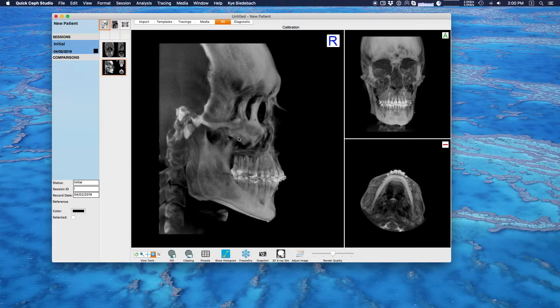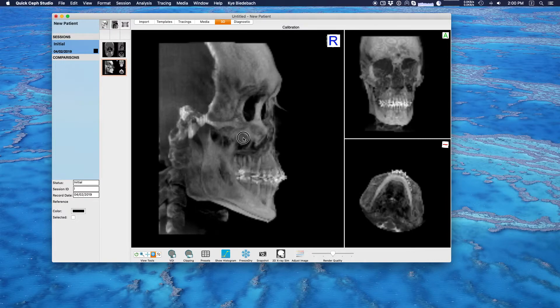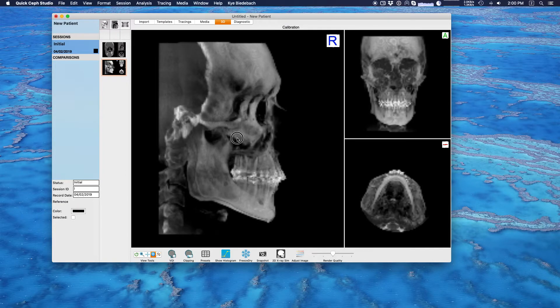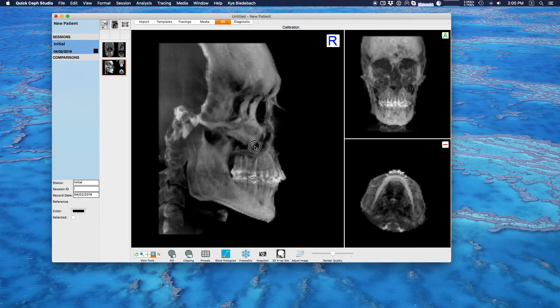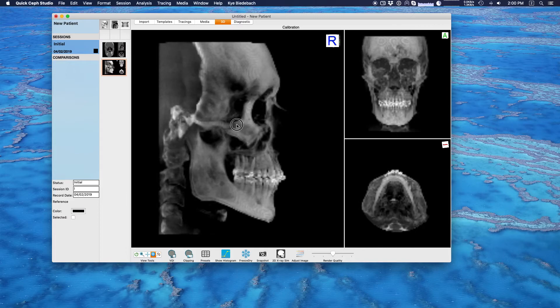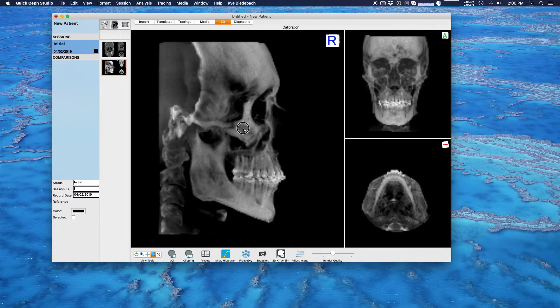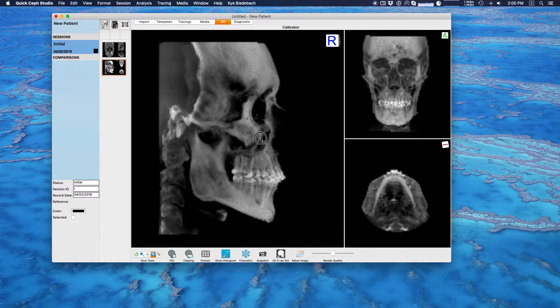There's the one I chose. You can see it's slightly askew — often the data will be a bit askew because the patient isn't maybe sitting straight in the chair. To calibrate this, all we're doing is lining up the orbitale and the hinge axis to make it look level. I can see that looks pretty straight on and to me that looks pretty good.